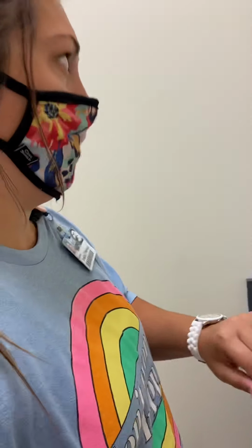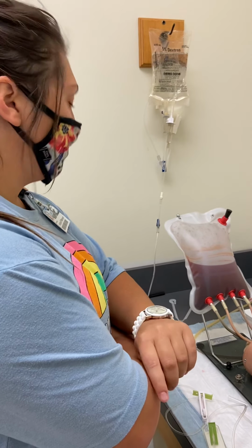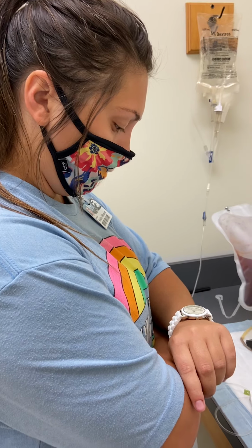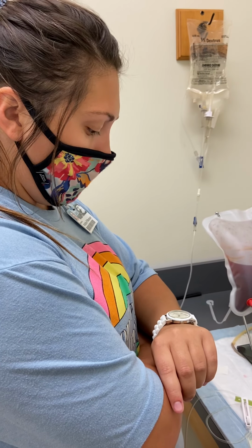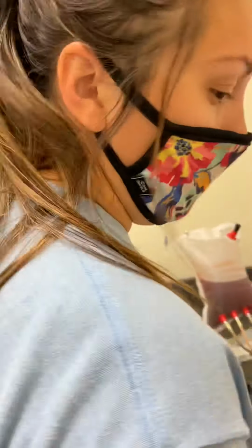And I'm monitoring for the rest of my minute and just make sure that he doesn't have any adverse effects. So I would dispose of all of this. Alright, Mr. Smith had no complications while I was giving the IV push.